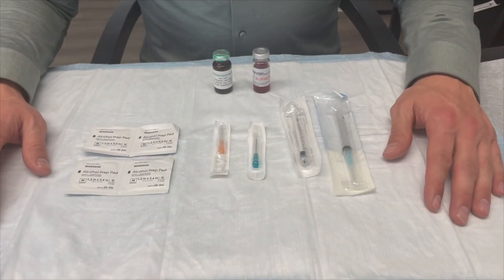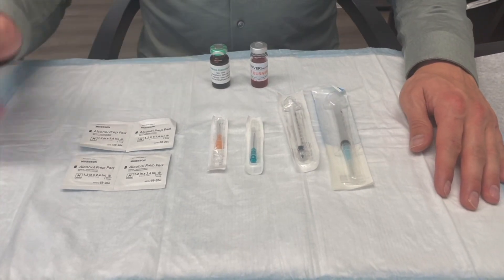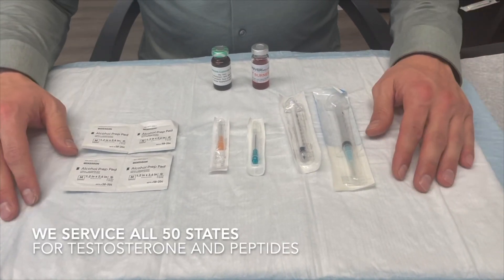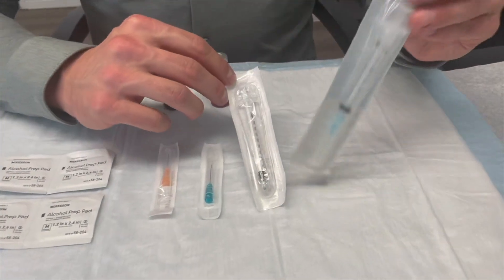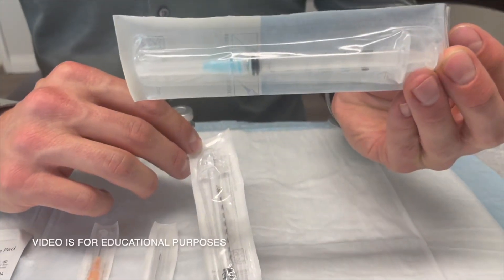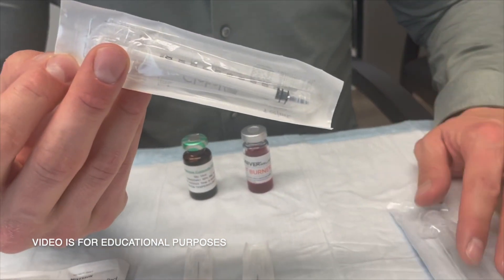When you receive your package you're going to receive syringes, needles, alcohol prep pads, and your medication. Depending upon what your dosage is, you're going to receive one of these types of syringes. We have a three milliliter syringe for a larger volume and we have a one milliliter syringe for a lesser volume.